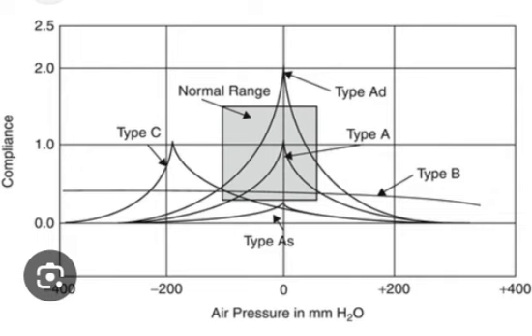Tympanometry. Published by Wikipedia. Tympanometry is an acoustic evaluation of the condition of the middle ear, eardrum and the conduction bones by creating variations of air pressure in the ear canal. Tympanometry is an objective test of middle ear function. It is not a hearing test, but rather a measure of energy transmission through the middle ear.